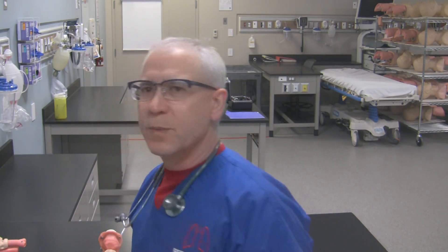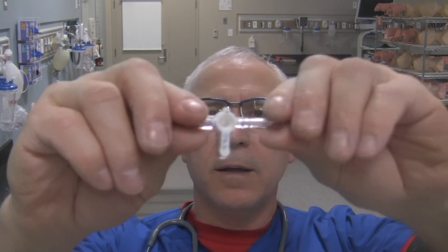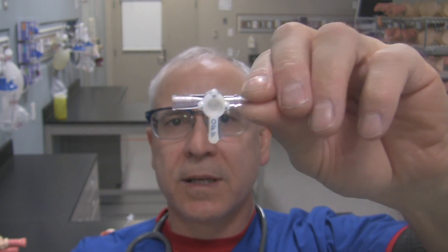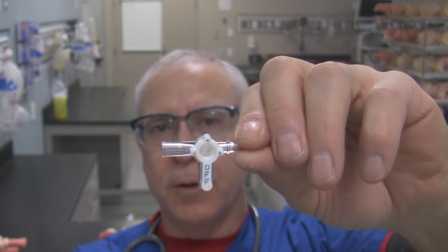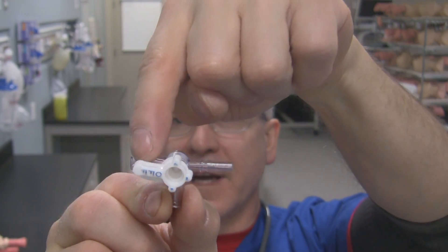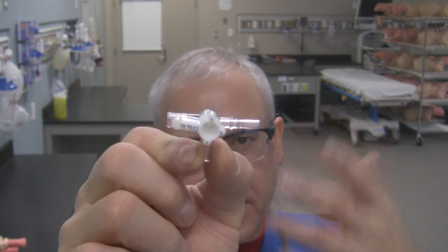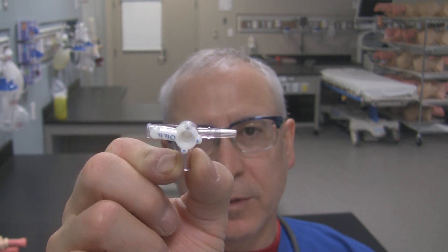So if you're working in a hospital and you're using a three-way stopcock, hopefully you'll understand the basics of how it works, and if you need to isolate a certain channel, you can isolate that channel. For example, if I go like that, you now know this channel is isolated and these two can communicate with each other. You can think about what you're going to do or what you need to do before you do it.